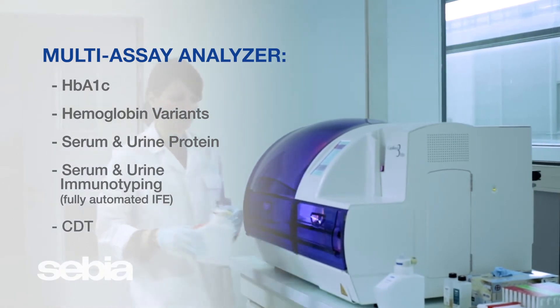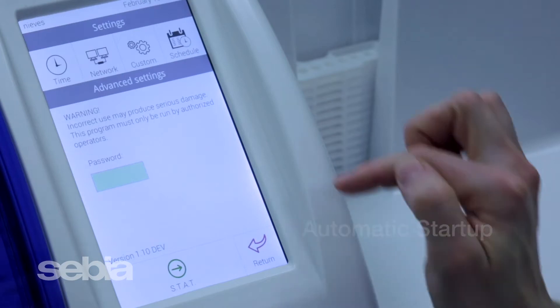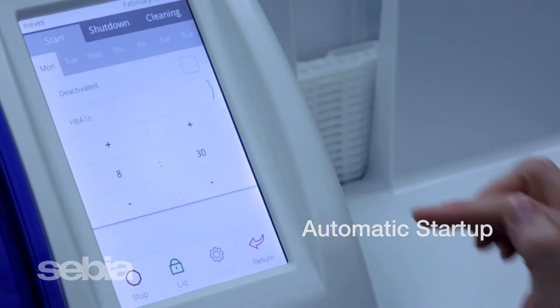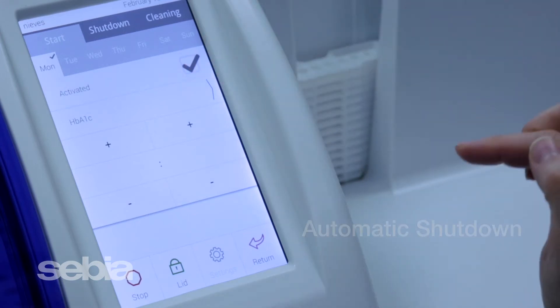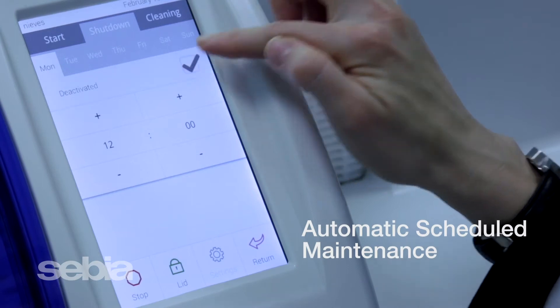Our customized software allows you to program the system for automatic startup, so the Capillaris 3 is ready to run when you are. You can also program the instrument for automatic daily shutdown and routine maintenance to free up valuable tech time.